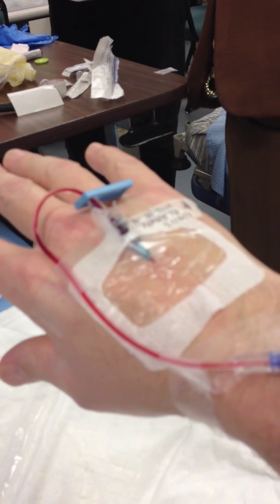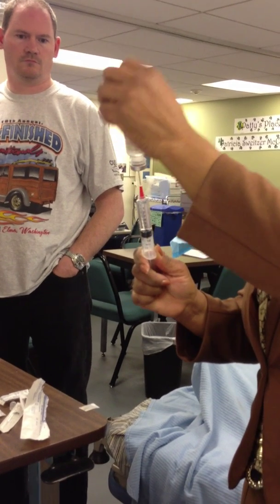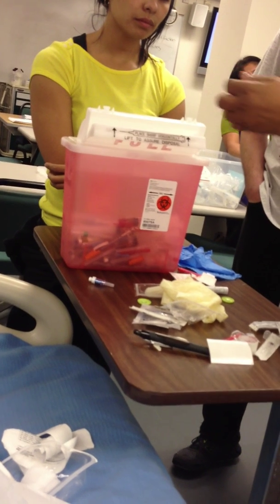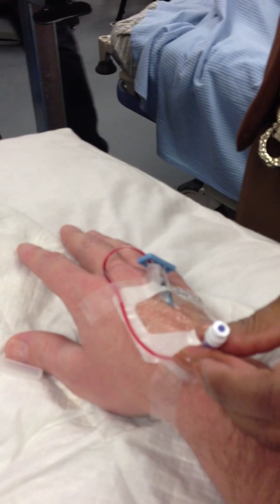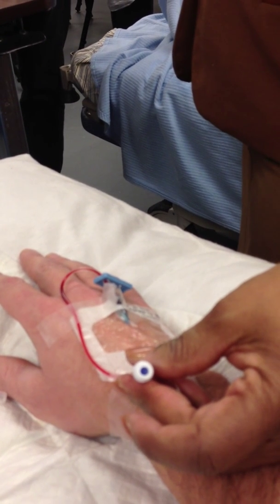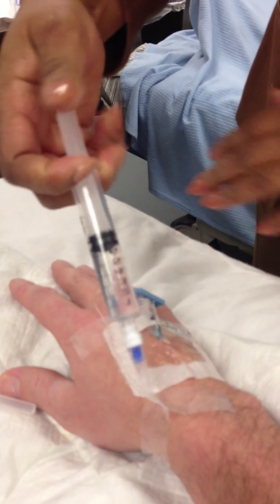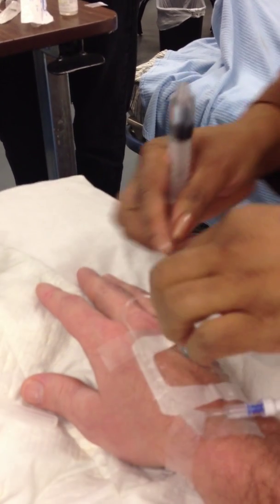Do you always just pull back with the saline like you did? Some people don't even put the saline in the tubing right away, but you're taught to purge your tubing with the saline so it keeps the blood from sticking and clotting. So I'm just going to flush his IV line to get that blood out, because if I leave it standing then it'll probably clot. Normal saline — this is a natural body component, elements of the body, so you shouldn't have a reaction to it. And because it has blood, you want to do it with a pulsating motion to sort of wash it away. Some people can say that they taste that.